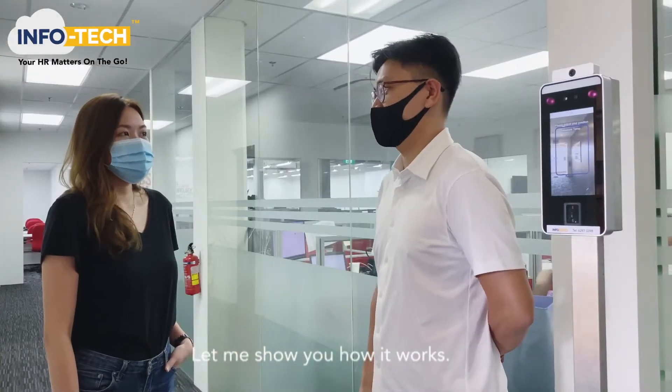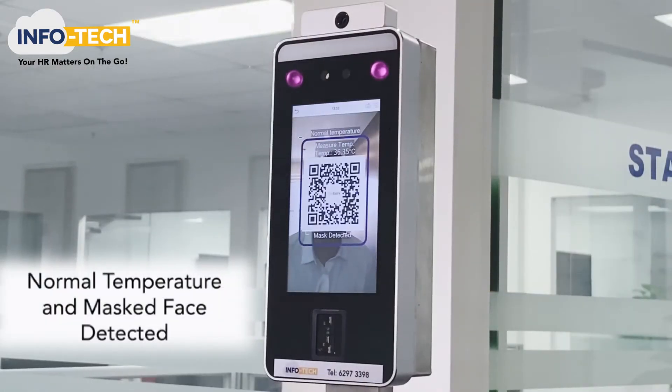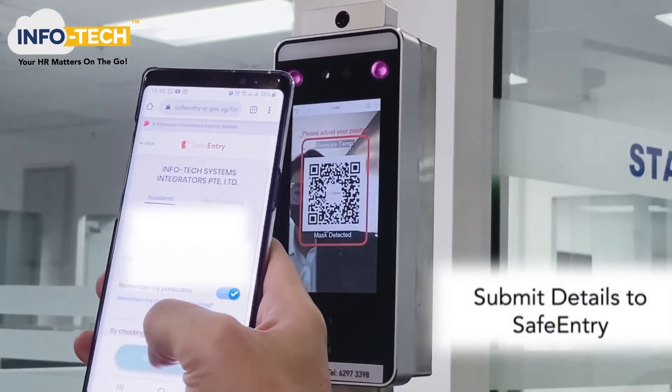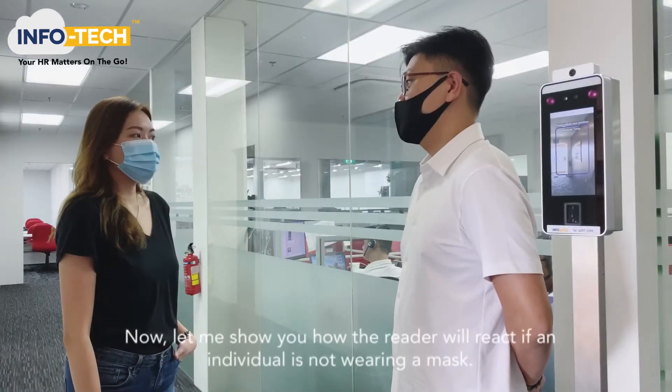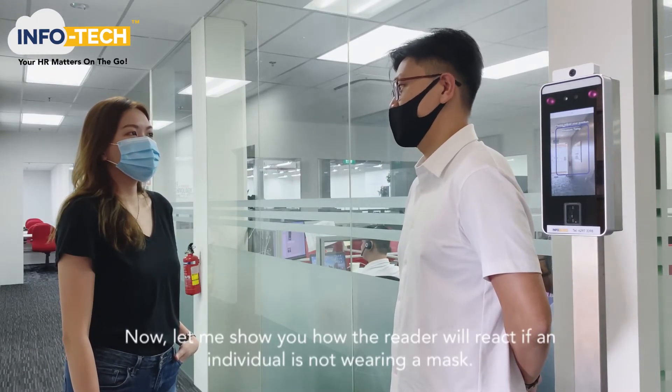Let me show you how it works. Please adjust your position for normal temperature. Now, let me show you how the reader will react if an individual is not wearing a mask.